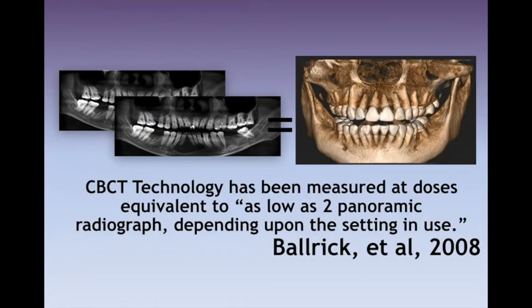That's where CBCT comes in. One of the particular advantages most CBCT companies would like to highlight is that it produces three-dimensional images, but with a significant reduction in radiation.